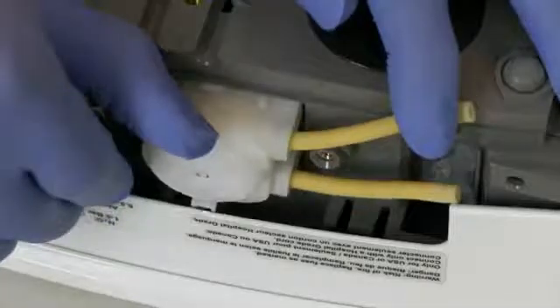Disconnect the two hoses, starting with the top one. Then slide the pump off its shaft.